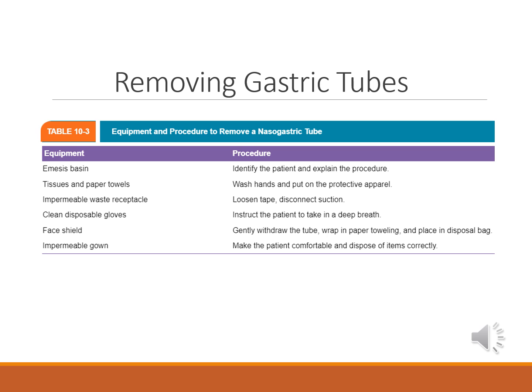The Levin tube, Salem sump, and other tubes positioned within the stomach can be removed relatively easily. However, it is crucial not to assume that the tubes can be removed just because an imaging examination is complete. The tube should only be removed if specifically ordered by a physician. NE tubes should never be removed by anyone other than a physician or a registered nurse.